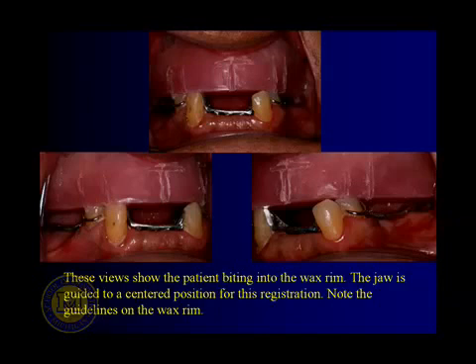Out at the desk they have this stuff called denture adhesive powder. So you go out at the desk, and in one of these little translucent cups that looks like a shot glass or a medicine cup, they give you some denture adhesive powder. So what you do is you take the maxillary record base and you get it moist on the inside. Take your air water spray and just spray the inside of it so it's damp all over. And then sprinkle some of this powder into that like you were putting powdered sugar on a bundt cake or something. Seat that in the patient's mouth real firmly.